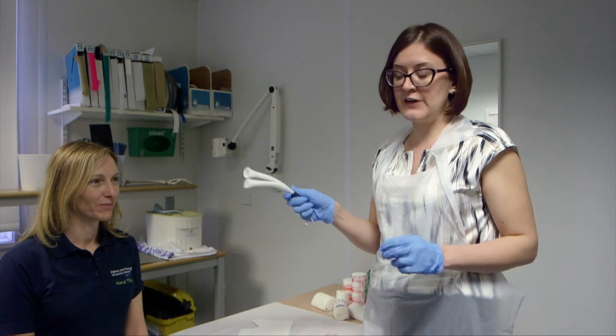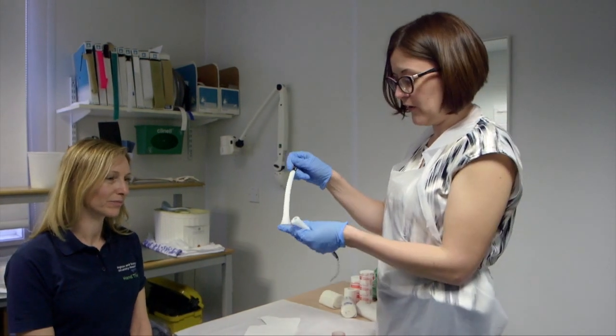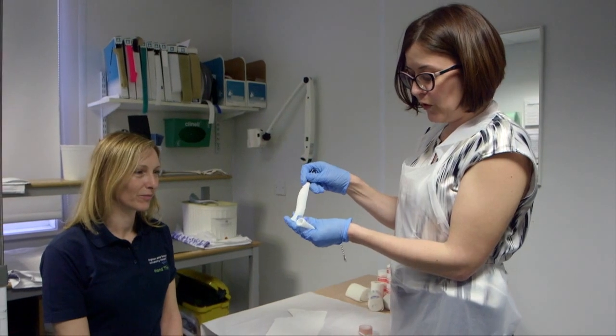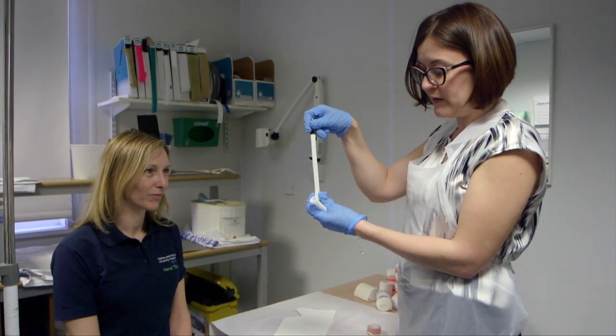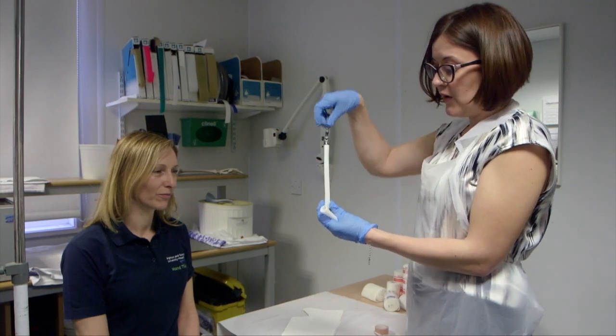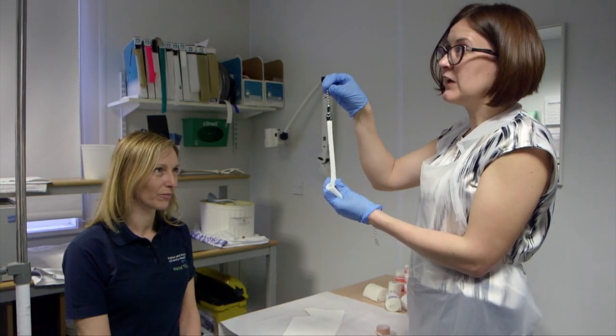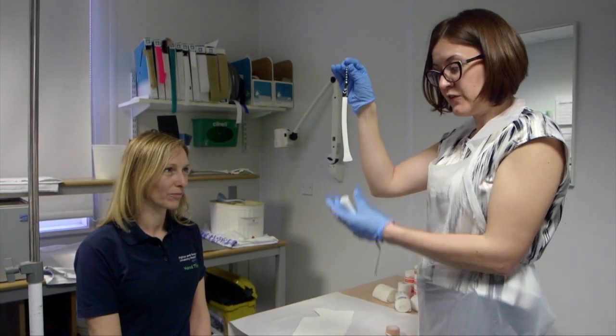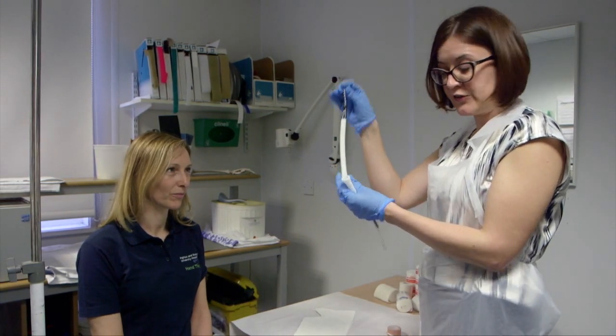Today we're going to show you a simple technique for distal radius fracture reduction using finger traps, which also makes it easier to apply the backslab. Finger traps are a simple plastic device that allows you to hold the finger tightly but in a non-occlusive way, and it's not painful for the patient. You then hang this from a string from the ceiling or from a drip stand, and as the patient relaxes, the fracture is gently reduced with longitudinal traction.